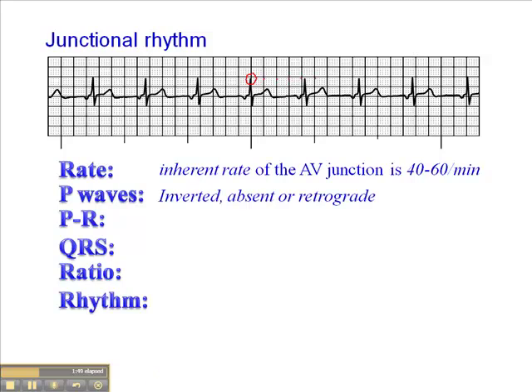The P waves in a junctional rhythm are either inverted — as we see in this case, in lead 2, the P waves are deflected downward — or the P waves may be absent or retrograde. It's important to remember that if P waves are absent, the QRS should be narrower in order to call it a junctional rhythm. The PR interval will be normal, short, or not applicable if we don't see P waves; it is typically short when we see inverted P waves.